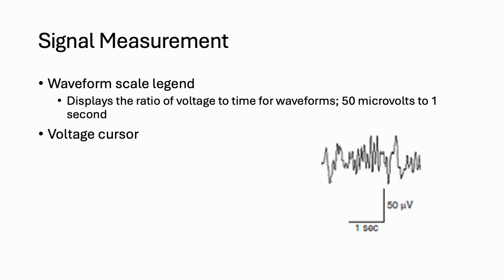Frequency and amplitude can be combined into a waveform scale legend that can be displayed over signal tracings. They are similar to legends on maps that show you distance in miles. These are helpful when screens are resized to fit different desktop workstations and different monitor configurations, so that the technologist will always be able to relate the waveforms to a known quantity.